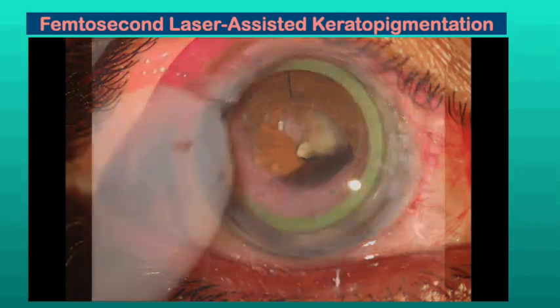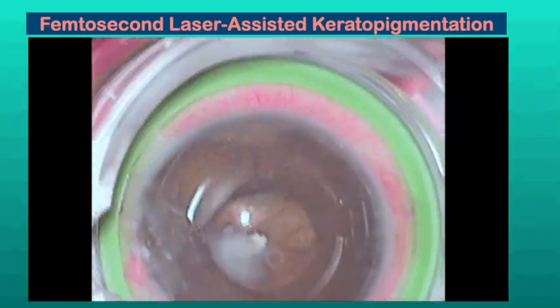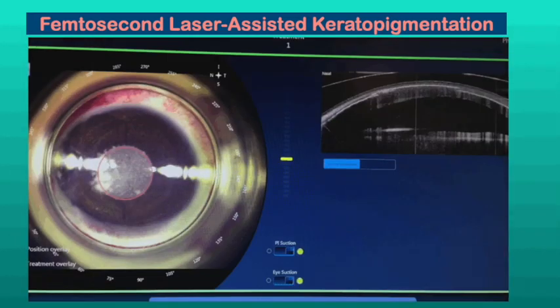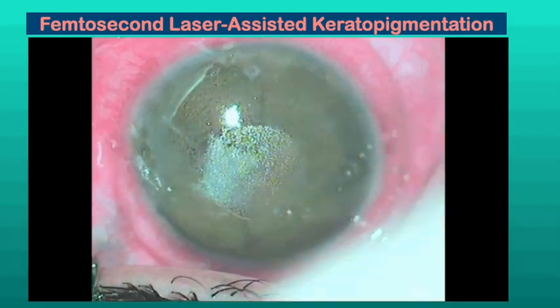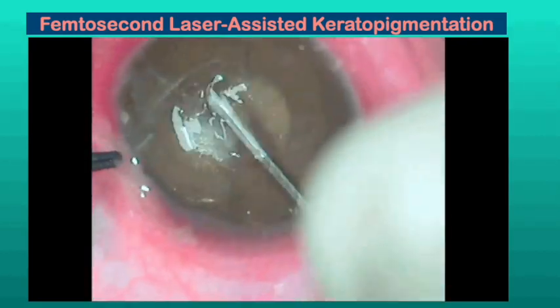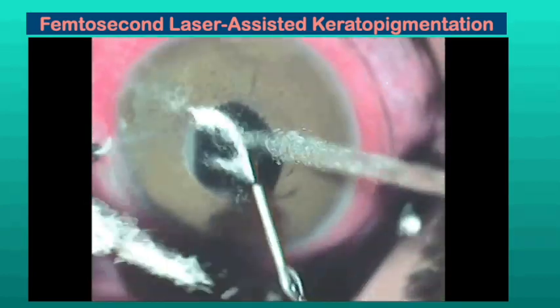The pupil can be done by automated manual technique or by femto, as in this case. If femto is planned, we should avoid interconnection of the two pockets. To avoid this complication, it is better to do the periphery and pupil in two separate sessions and use different depths.